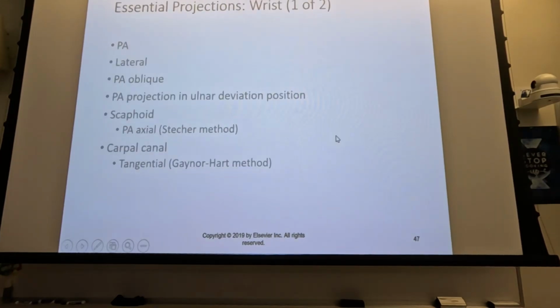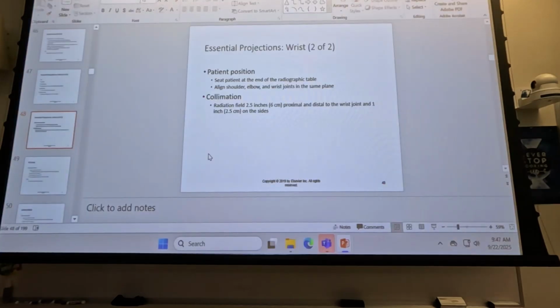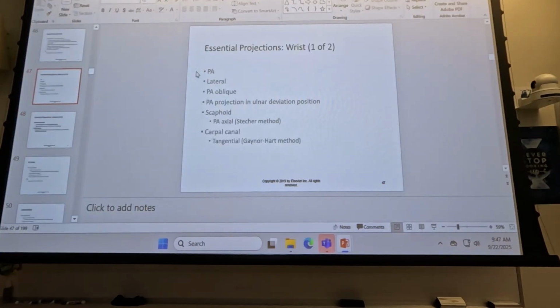Okay, so that's hand. Let's talk about a couple of projections of the wrist, and then we're gonna be done.